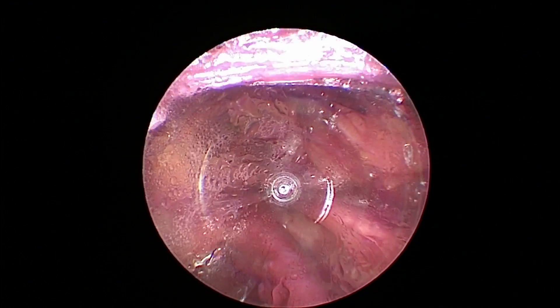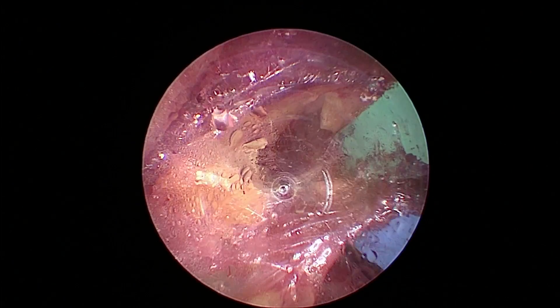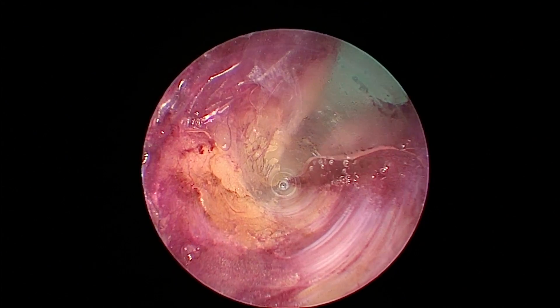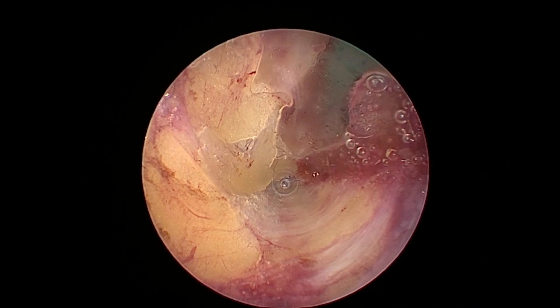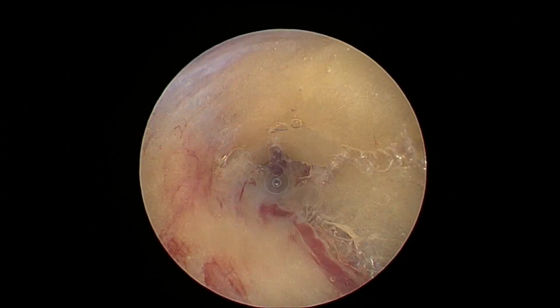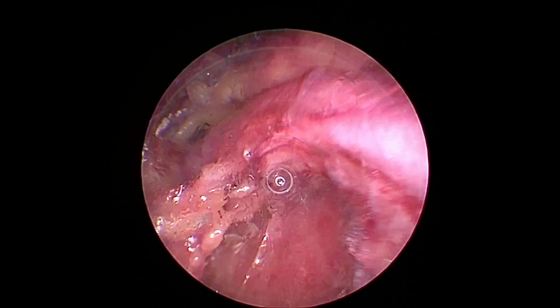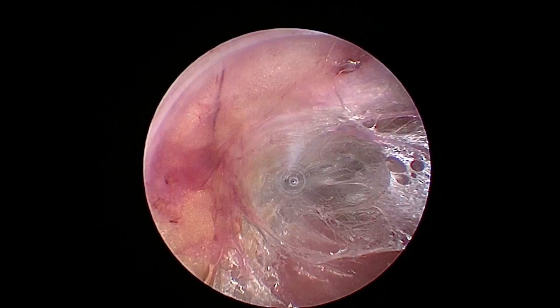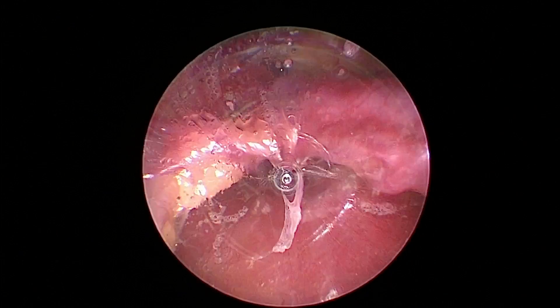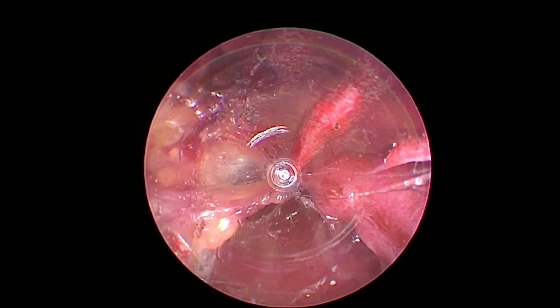So I'm going to go lateral, make a little space, go into my fasciotomy. I've made space above the fascia and I'm not worried about any thermal spread because the energy delivered with the device is just between the two fine blades. It's a high burst and it's tailored to the tissue between there — the smaller the branch, the less energy that gets delivered, so there's less charring and less thermal spread. I like to work circumferentially, which keeps the pedicle intact and reduces my chance of avulsing any branches.